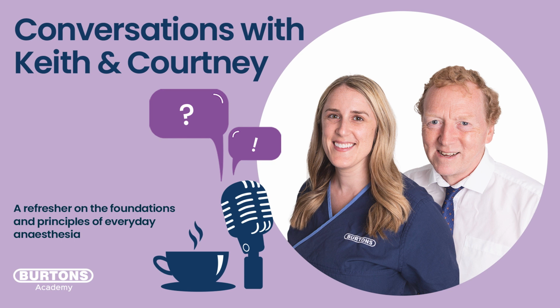And the only way you're going to do that is to have a capnograph. So you can ventilate without a capnograph, but you're absolutely flying blind. So you really need to have a capnograph. So that's it, a little bit of physiology. We just need to exploit those processes, and then we can take over ventilation.